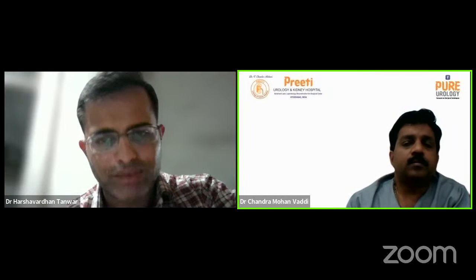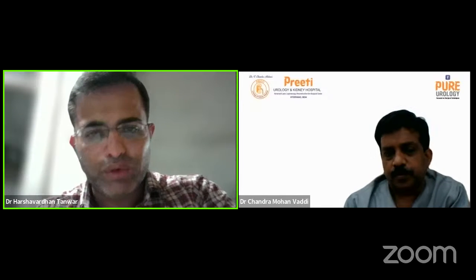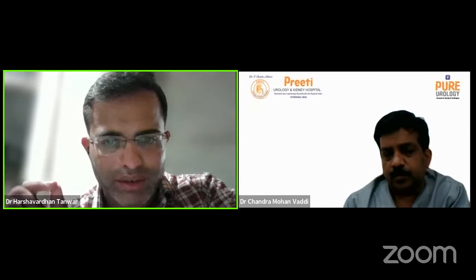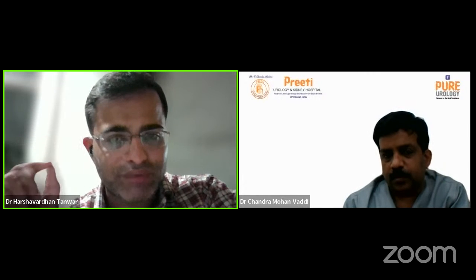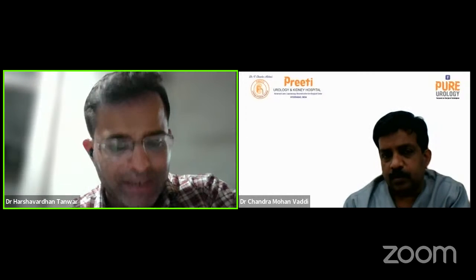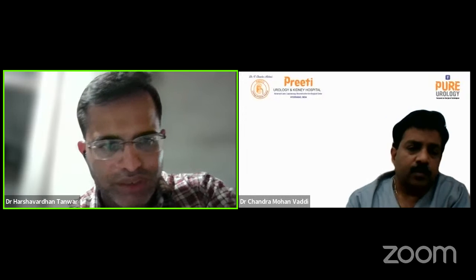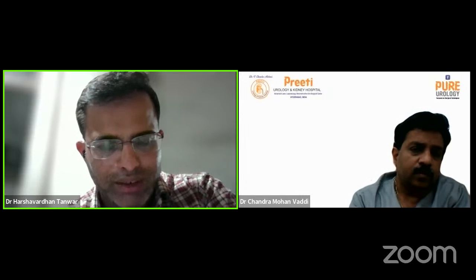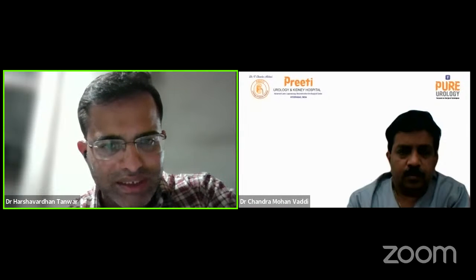Okay, fine. Sir, a very nice question. First of all, I would like to say that we have all learned in PCNL that it is the posterior calyx in the prone PCNL that we have to hit, because it is the most superficial calyx in a prone position. And in all the videos, I have shown that in doing monoplanar technique, I am trying to hit the posterior calyx so that the wire goes easily inside.